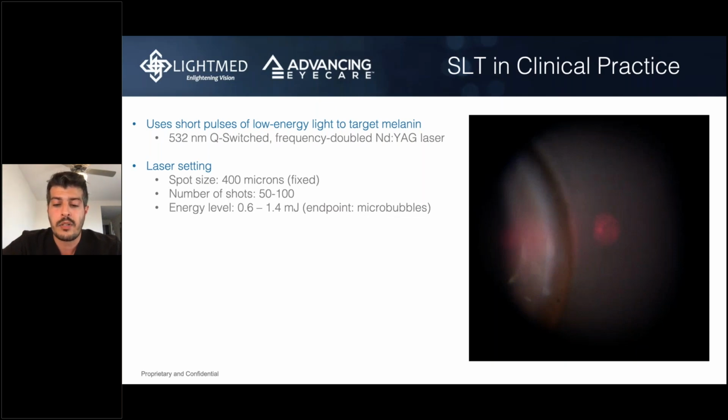In fact, the higher the eye pressure, the higher the chance or the lower your eye pressure reduction will be. So again, as I said, doing SLT in a patient with pressure of 30 will have a much higher response than in a patient with a pressure of 12, for example. Now, in this, the specific question was, let's say someone's pressure is really high, 50.